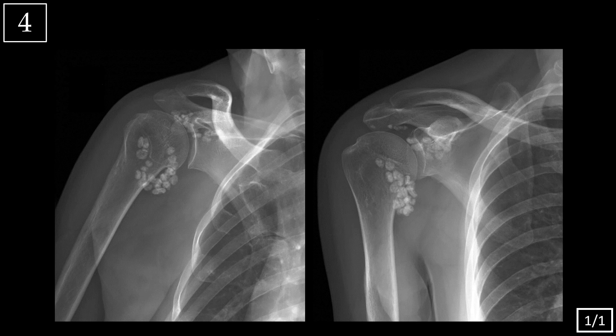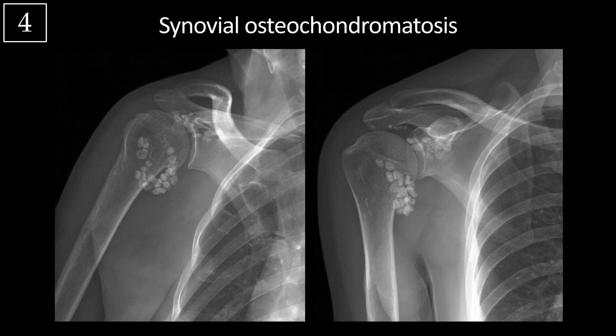Case four. Here we're looking at two views of the right shoulder. The shoulder joint is intact and there's no evidence of fracture, but we see numerous small ossific densities scattered about the shoulder joint, all similar in size. This is characteristic of synovial osteochondromatosis — a synovial metaplasia and proliferation that produces multiple intra-articular cartilaginous loose bodies that may or may not ossify.